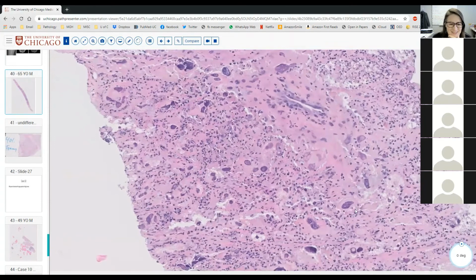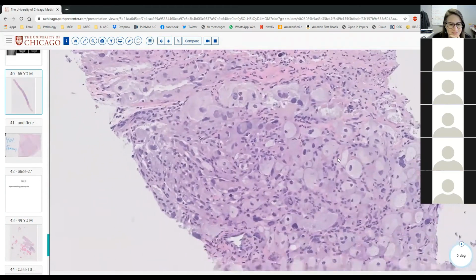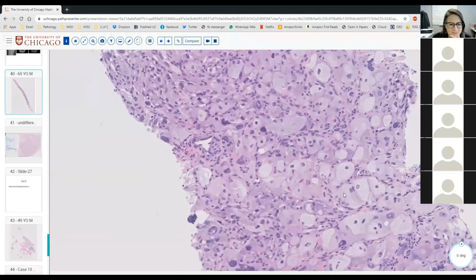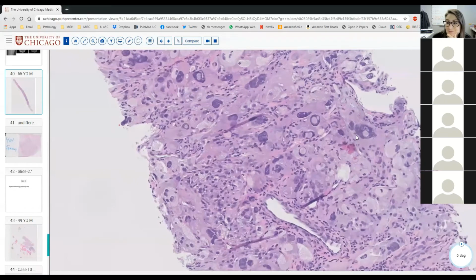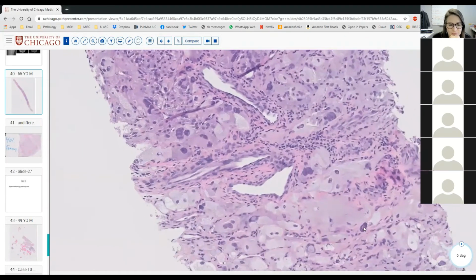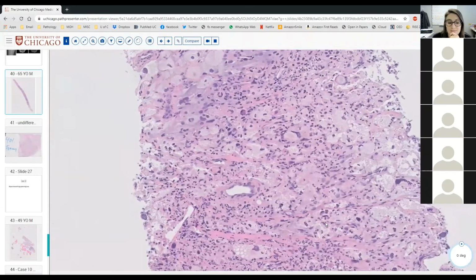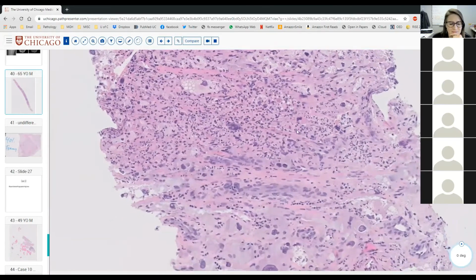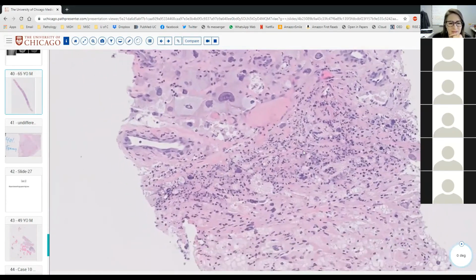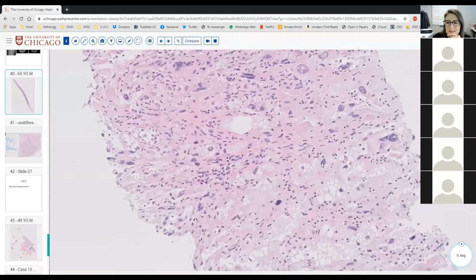Right. So, it's even worse than what I've seen so far for liposarc, like a very not differentiated, well differentiated liposarc. But definitely some of those atypical cells, and it's not the location you usually think of for that, but some other sarcoma too.